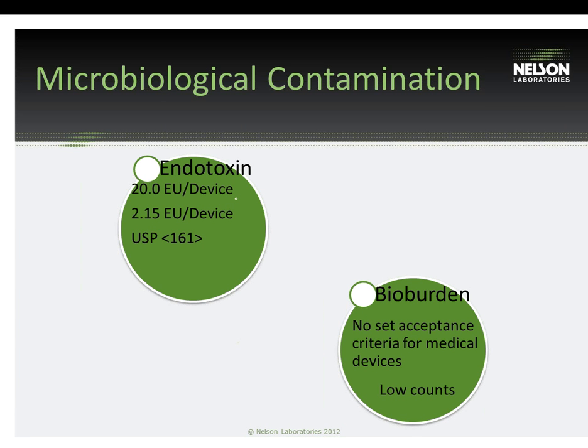And again, like what we discussed with cytotoxicity, a lot of people may argue that their bioburden is going to have to be performed as part of their sterilization validation. And again, that's fine. There's definitely no requirement that says you have to include it as part of the validation, but you can see how it can be a helpful tool in providing more data about your device and trying to show that it's clean.